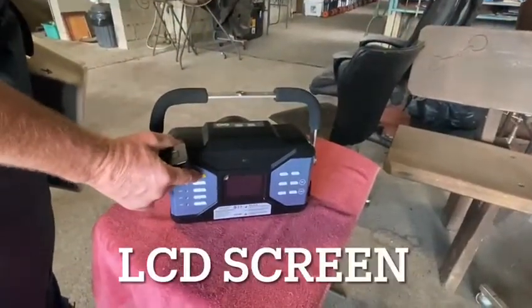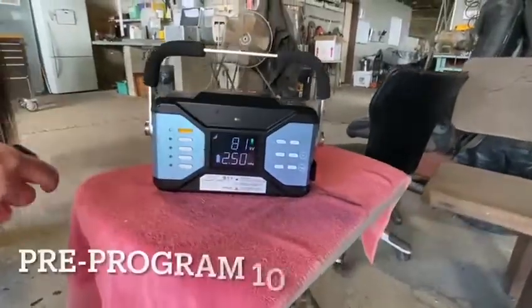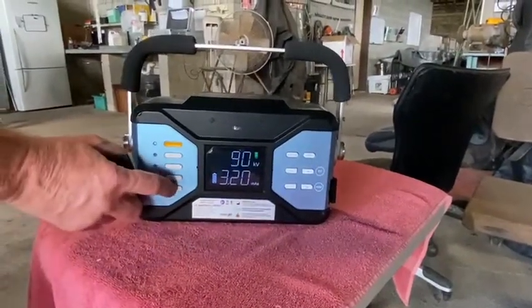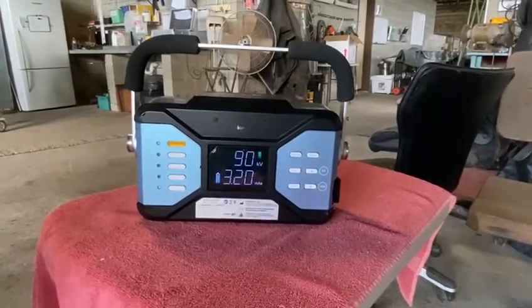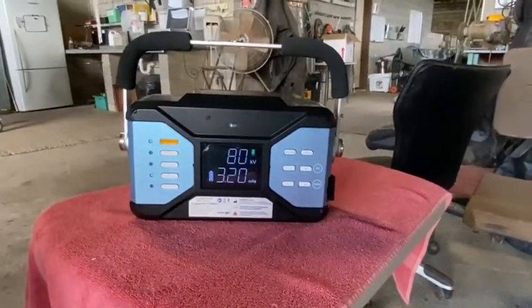You can turn it on and it's got this LCD screen here. It's got 10 settings that you can choose to do x-rays with. We're going to do a stifle x-ray here - a posterior anterior. We'll choose 80 kV and 3.2 mas which is 0.16 time.